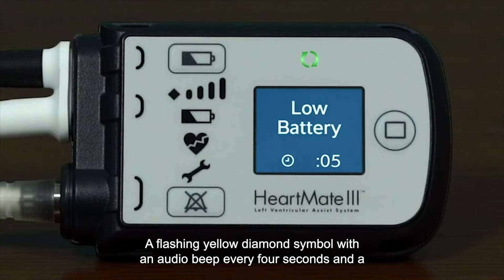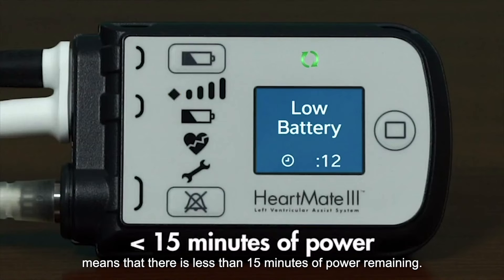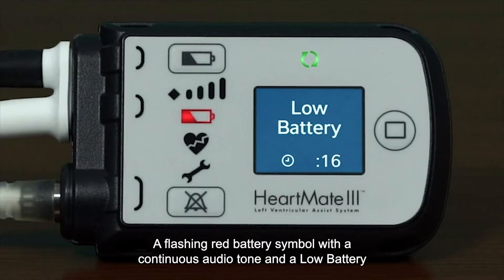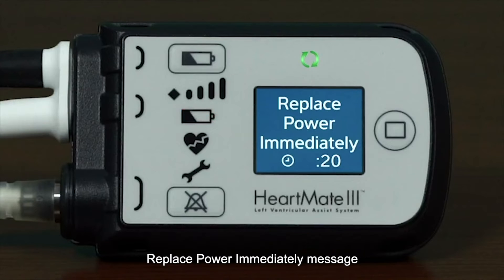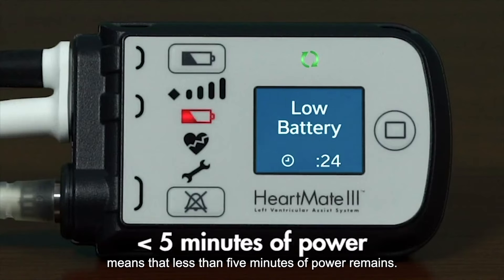A flashing yellow diamond symbol with an audio beep every four seconds and a message indicating low battery replace power means that there is less than 15 minutes of power remaining. A flashing red battery symbol with a continuous audio tone and a low battery replace power immediately message means that less than five minutes of power remains.